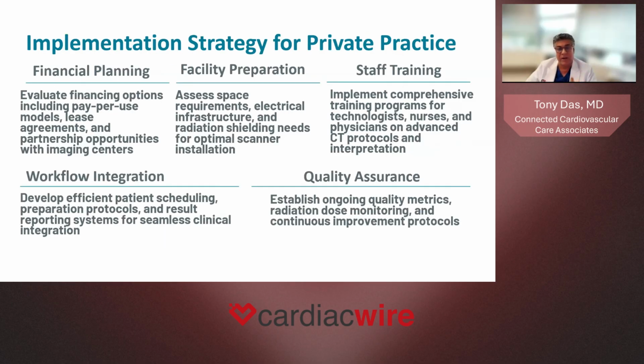So implementation strategy for us has been, we planned on putting a CT scanner in. We identified our partnership with Arineta. We've prepared our facility, got our training done. We integrated it into the workflow.